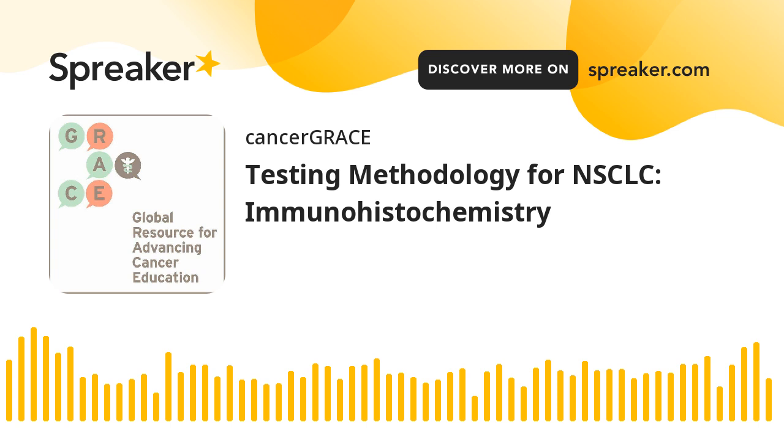Some practical applications are the following. So for resource-limited settings, IHC can actually be really useful to confirm the presence of an ALK gene rearrangement, and specifically if you use the D5F3 antibody. It will be used to determine PD-L1 tumor proportion score, and we'll talk a little bit more about that. And it will also be used as a target for antibody drug conjugate trials. And I've just listed several trials that are ongoing here.